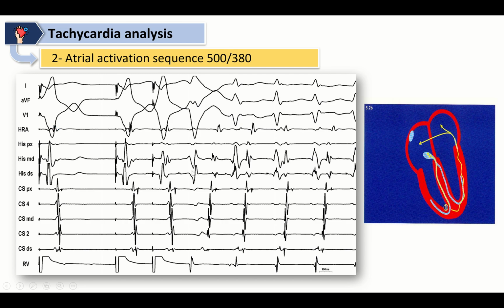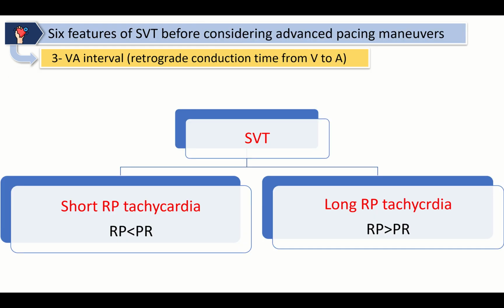After stopping the ventricular pacing, the tachycardia continued, and we can see a narrow complex tachycardia with 1-to-1 conduction with earliest atrial activation at distal CS 1-2. So it confirms the presence of a left lateral accessory pathway. So this patient has right and left accessory pathways.